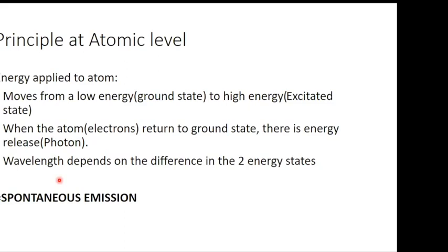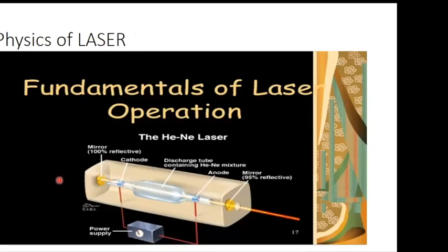And then now, this is just to show how a laser is made. So it's still the power source, and remember what I've just explained happens at this level.